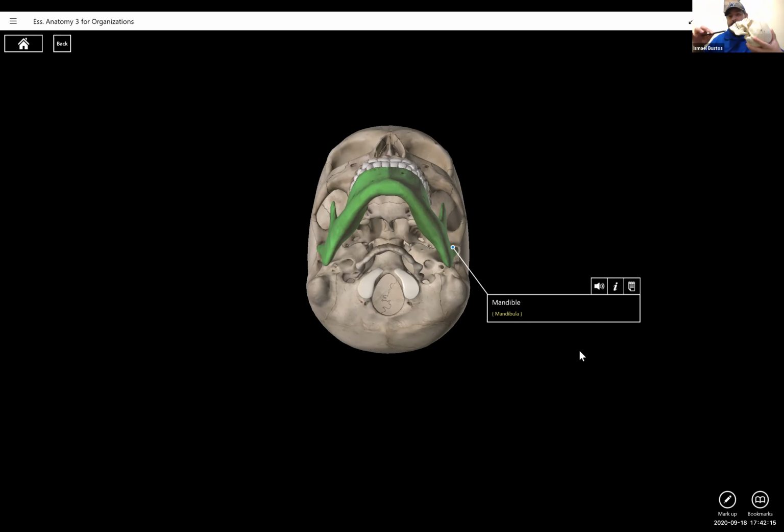So what we need to do is make sure that our CR is perpendicular to the IOML, and that'll help guarantee that these mandibles are not going to get superimposed over the mastoids. So again, it should be like this with the CR coming perpendicular to the IOML. If the patient cannot fully extend, we still don't want the CR coming straight. We want it angled to be perpendicular to the IOML.